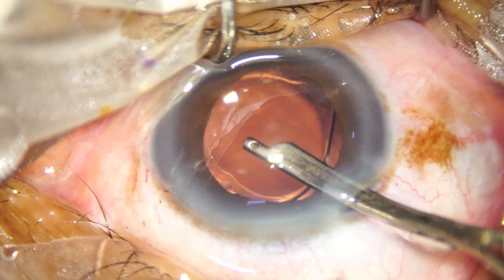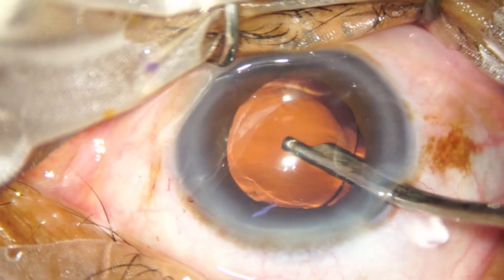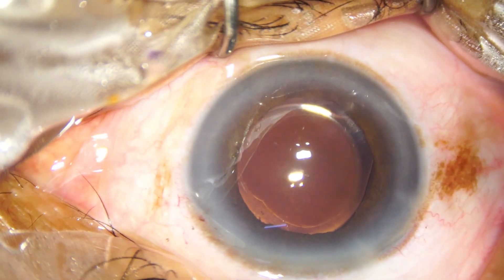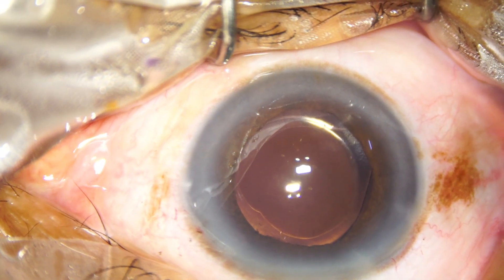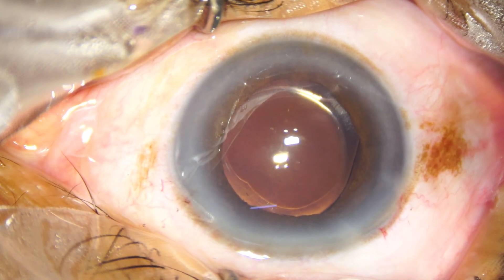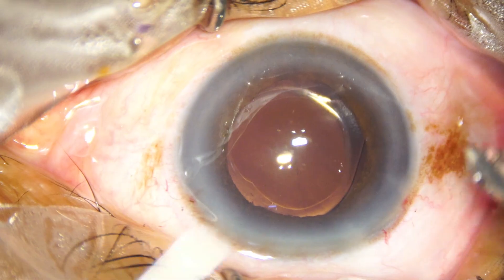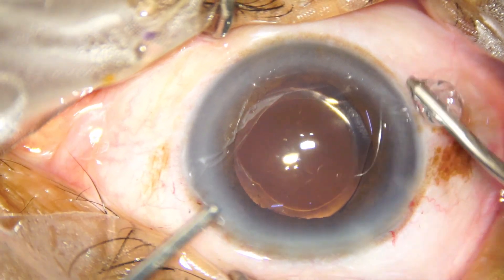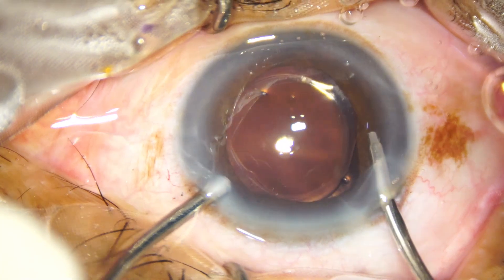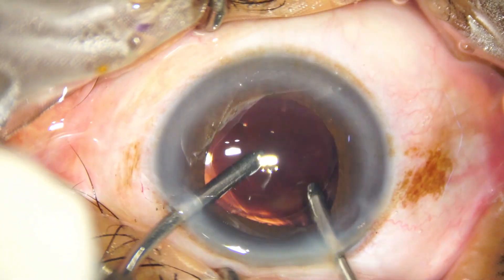So, I go behind the IOL both with Simcoe as well as with irrigation-aspiration cannula. Here goes the bimanual irrigation-aspiration — irrigation goes through the main port, aspiration through the side port.